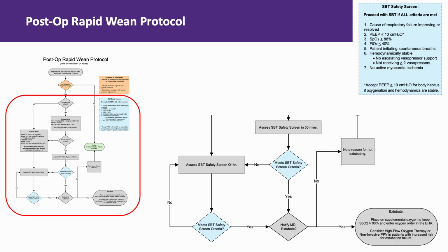Let me emphasize that last point because it comes up a lot. Post-op rapid wean patients do not need a separate SBT. The protocol itself incorporates the assessment of spontaneous breathing. If the physician wants a formal SBT on top of the rapid wean assessment, they'll order it. Otherwise, once the patient meets extubation criteria, get the order and proceed with extubation.